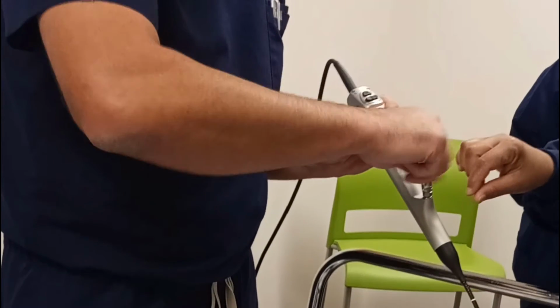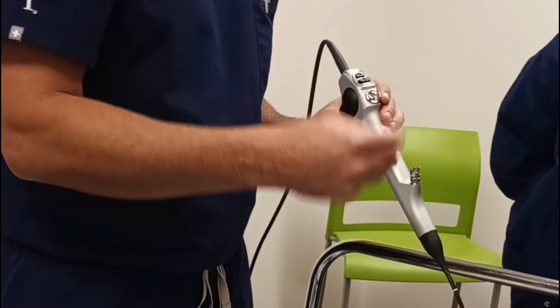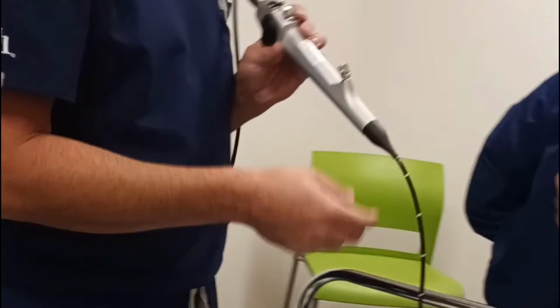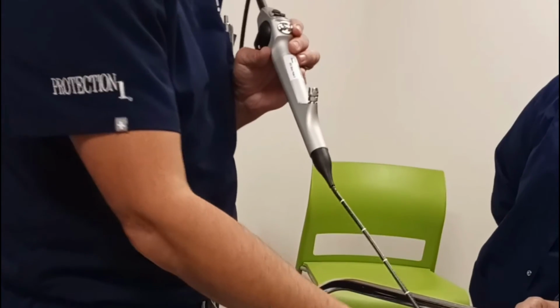Just stick it down and just twist and turn it, and you pull it out. You wipe just to the end of the brush. Yeah, yep. And then you pull it out. You don't want nobody jamming it in because it might not know. I'm talking about right now. I'm just talking about the long brush that goes through the whole scope, right?